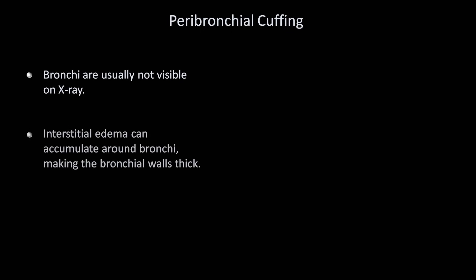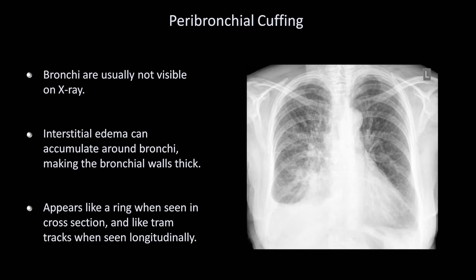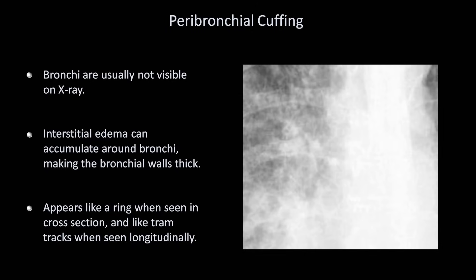Visible bronchi are not only a manifestation of air bronchograms, but also of peribronchial cuffing. Interstitial edema can accumulate around bronchi, making the bronchial walls thick. This appears like a ring when seen in cross-section, and like tram tracks when seen longitudinally. Here is an x-ray with a number of different findings. If we zoom in on the right mid-lung zone, we can see two ring-shaped structures adjacent to one another, which are bronchi seen in cross-section.